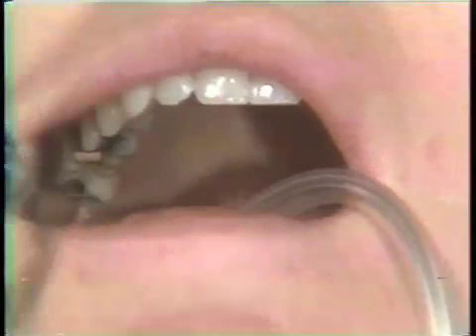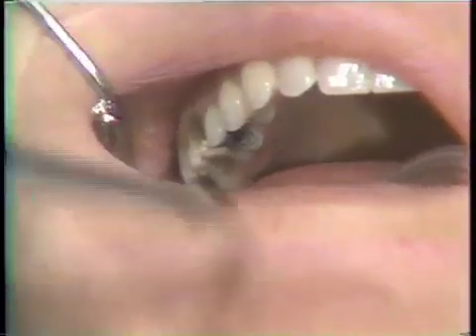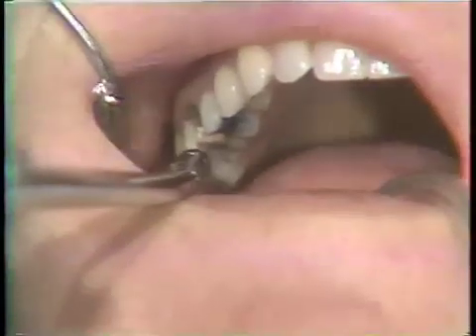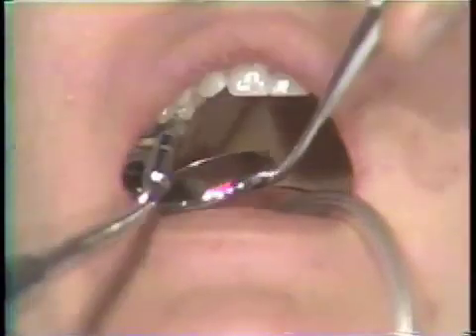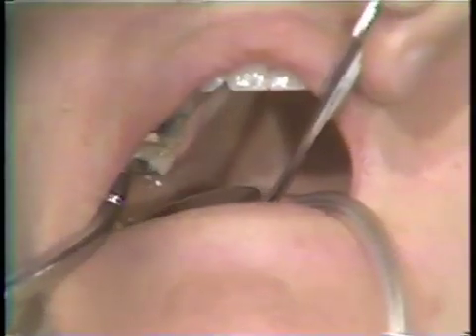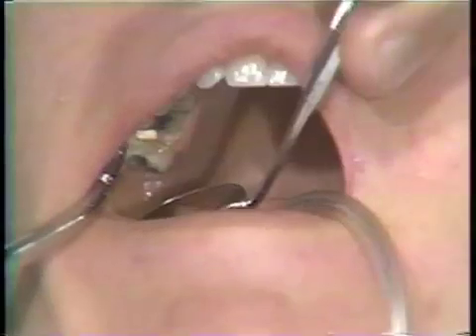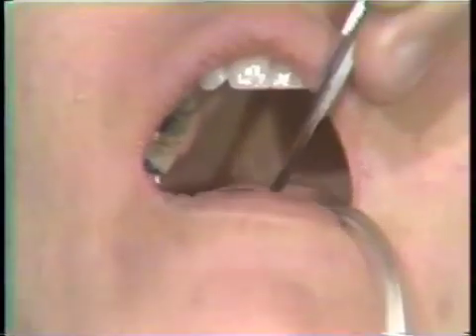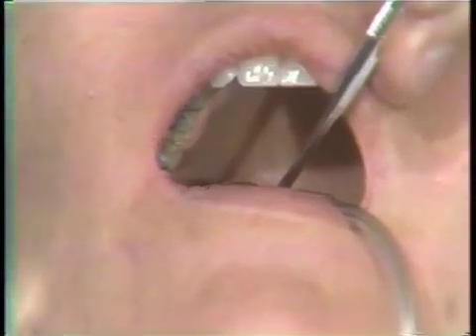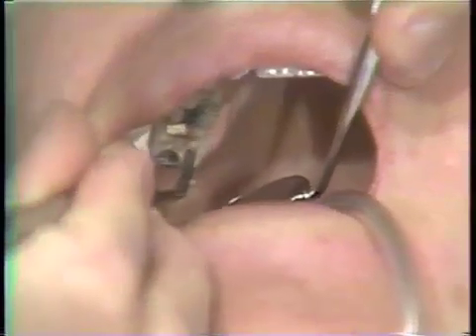Preparation for the cementation procedures. Final spray of air and water, rinsing of the prepared tooth. Drying and placement of cotton roll isolation in this quadrant. Now the preparation of that tooth and the area around the adjacent tooth will be dried thoroughly with the air syringe.